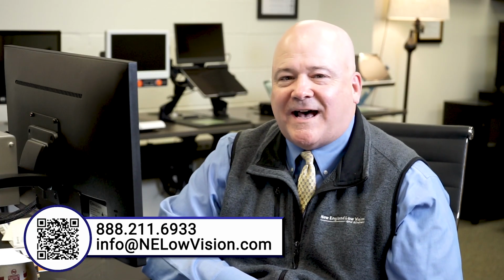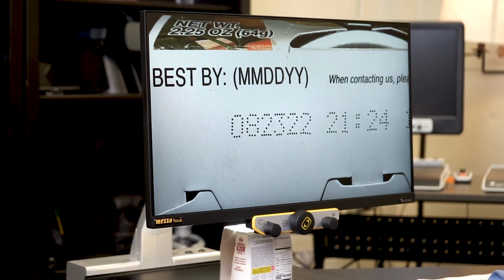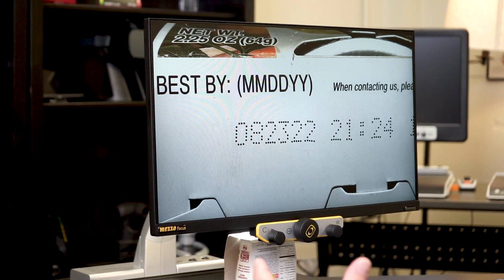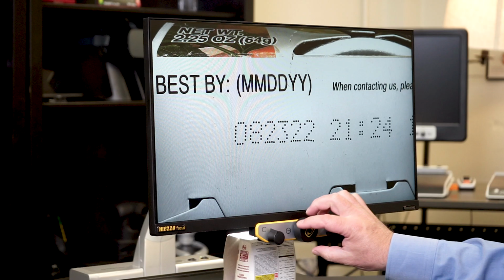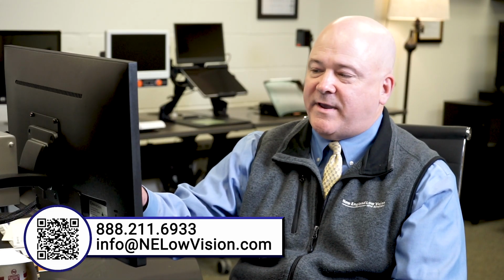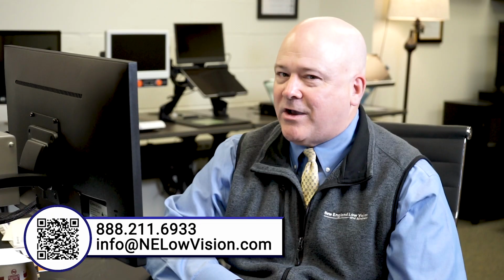Okay, and so the next item I want to put underneath the Mezzo is a food item. These are ramen noodles, and I have these on the shelf. You might have some item like this on your shelf. You want to take it out. You want to see, is it expired? Has it been there for a while? I have best if used by, and can you see the date there? Let's make that a little bit bigger. They're not printed very well, so it's hard to make out. But when we magnify, you can kind of make out the numbers, 082322. So am I going to eat these noodles?